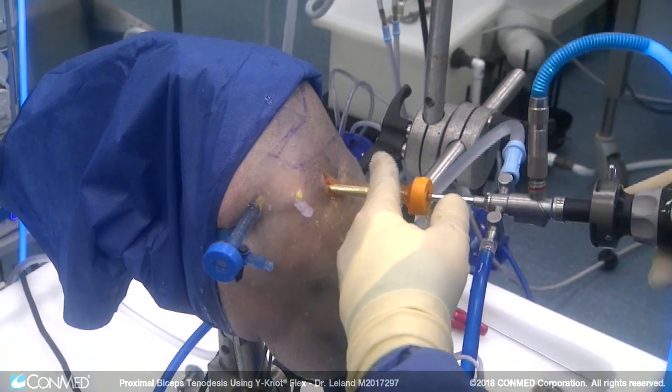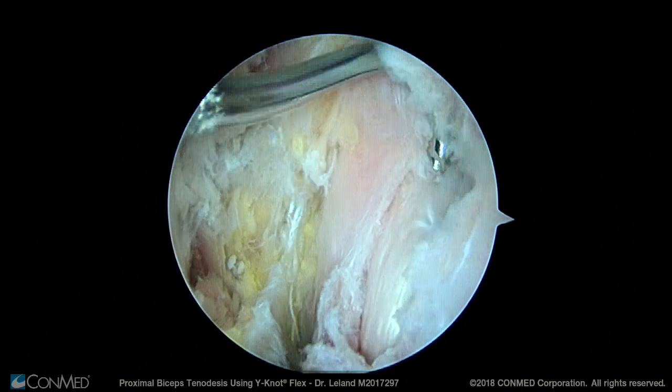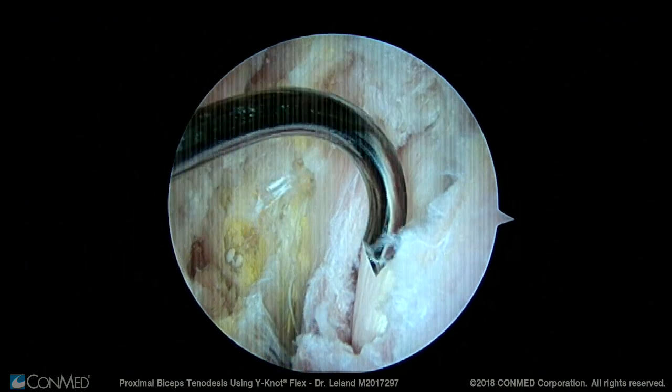Now I put the scope through the lateral portal so we can clearly visualize the biceps tendon from the subacromial space through the rent in the overlying tissue that we had made when the scope was in the glenohumeral joint.